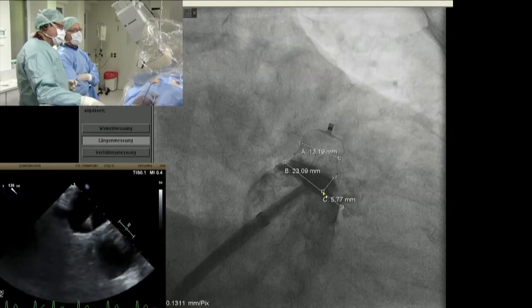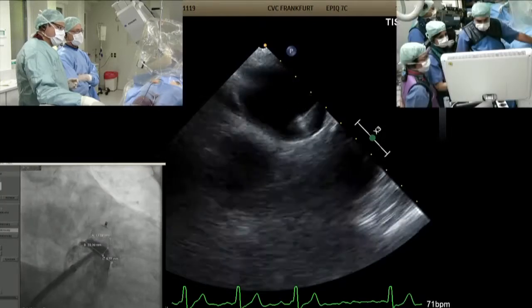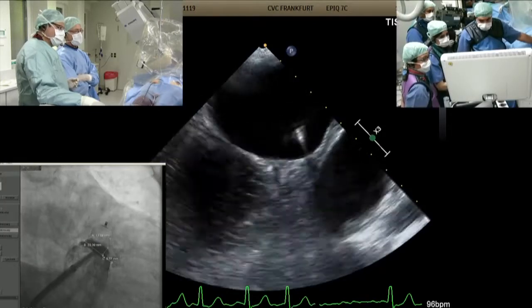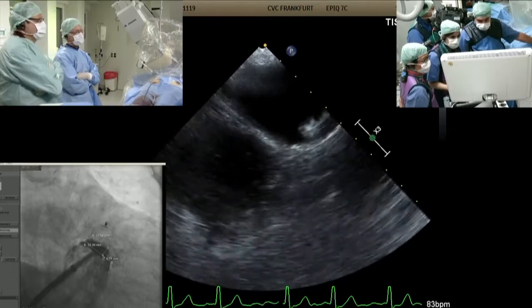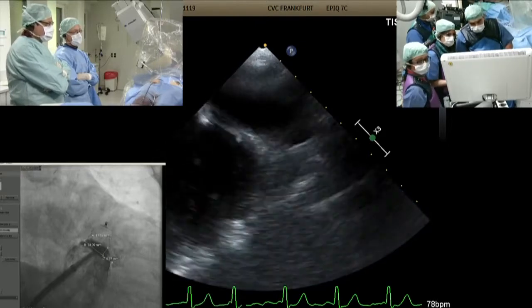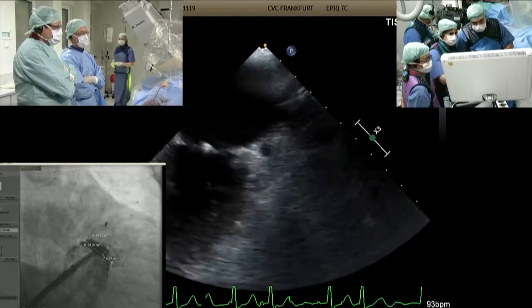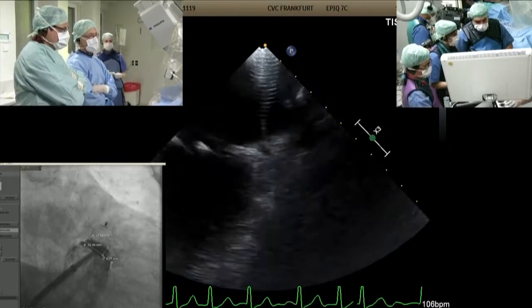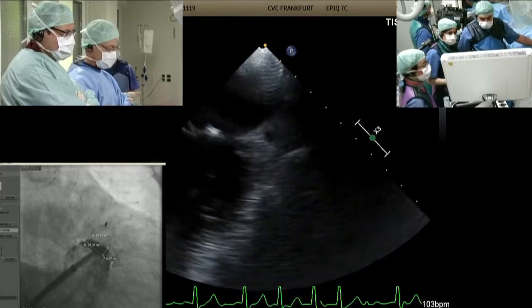I'm waiting for Bushra for the residual leak, how big that is. We're just trying to get some images at the moment. Yeah. The question is what happens with the disc when I release that device. Will it then move towards the leak or in the opposite direction? I don't know that. So the leak may either disappear or get bigger. Do the 45 and we'll look for it on X-plane.